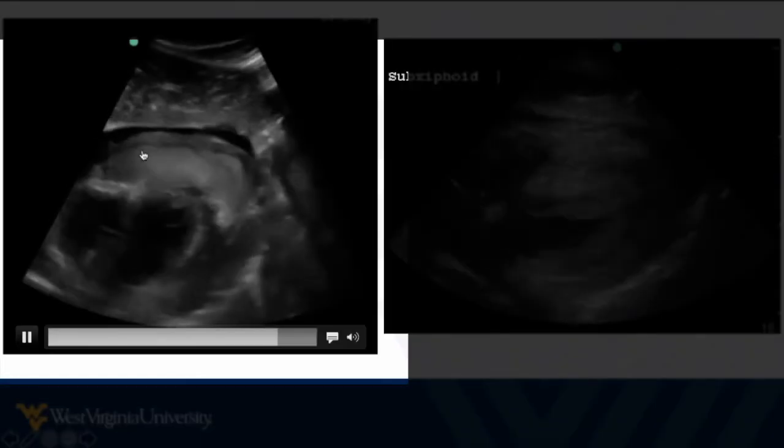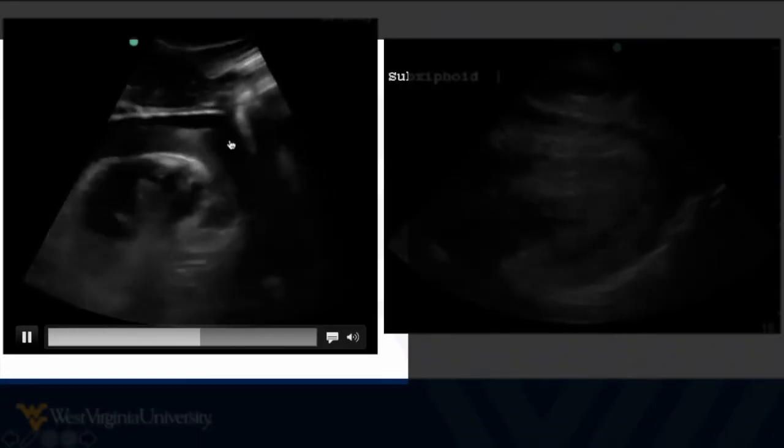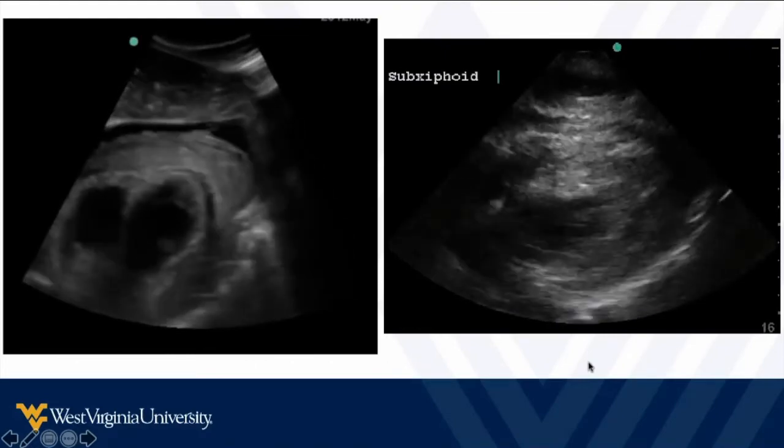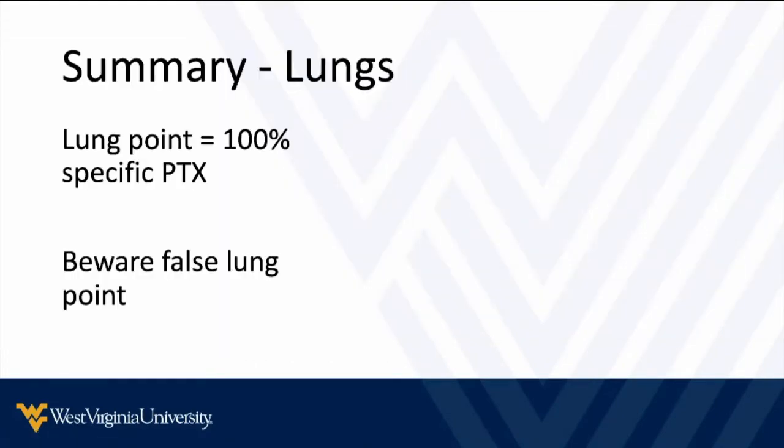And then lastly, we've looked at examples of this already. Blood can be gray in the pericardium. Look for these examples. I think we beat the heart to death, so I won't beat it to death any further. Some of the things in the lungs, and pitfalls and little pearls to recognize.